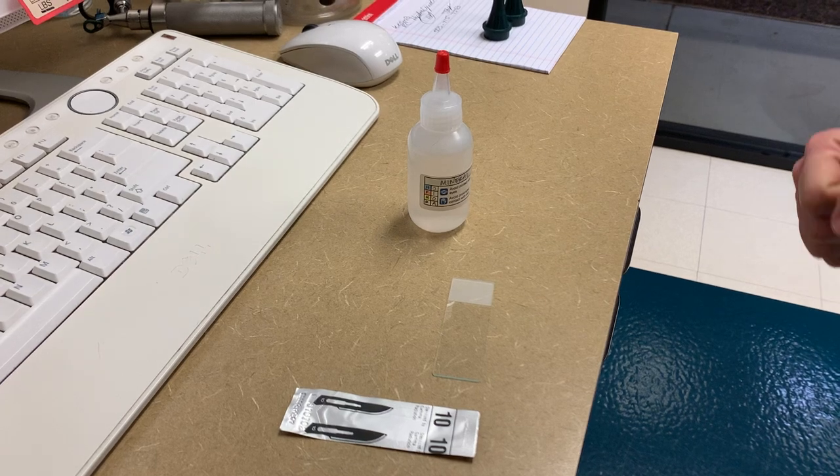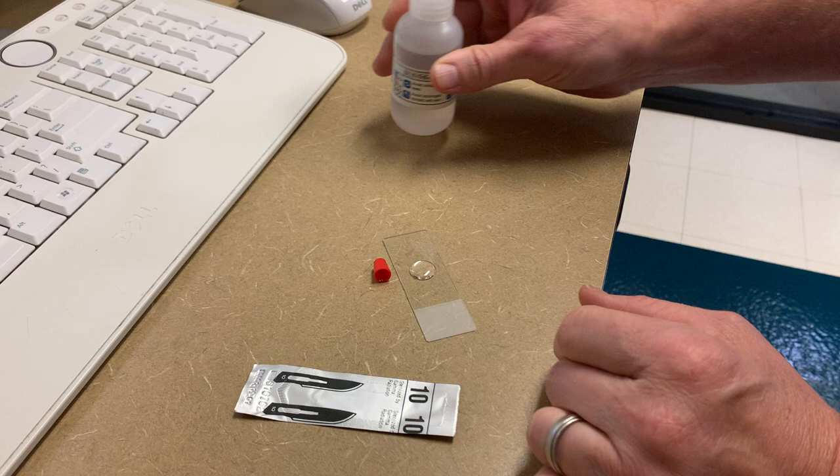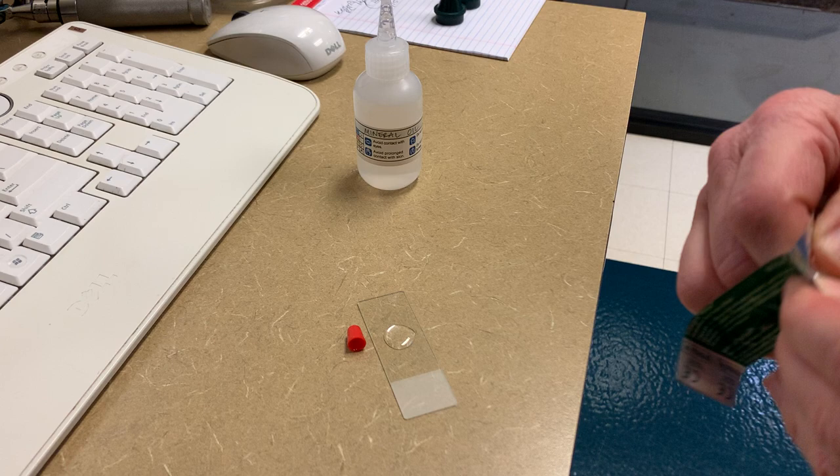We're going to do a skin scraping here and show you how to do a superficial and then a deep skin scraping. We'll take a little mineral oil, put about a dime-size drop on the slide. I use a number 10 scalpel blade.